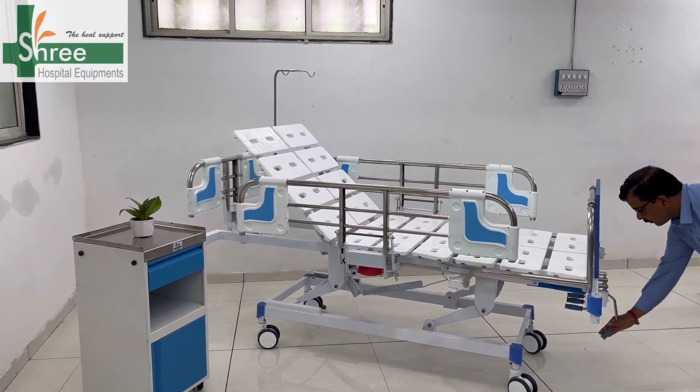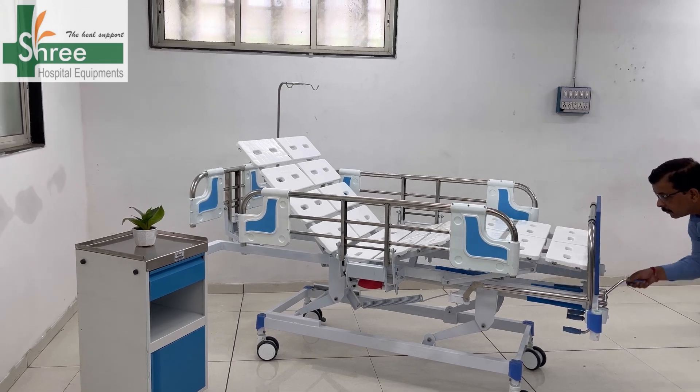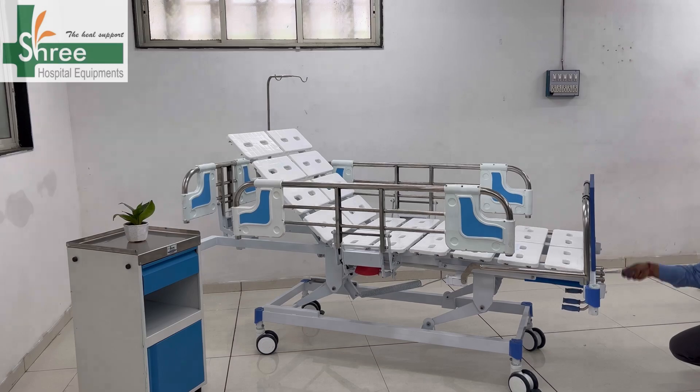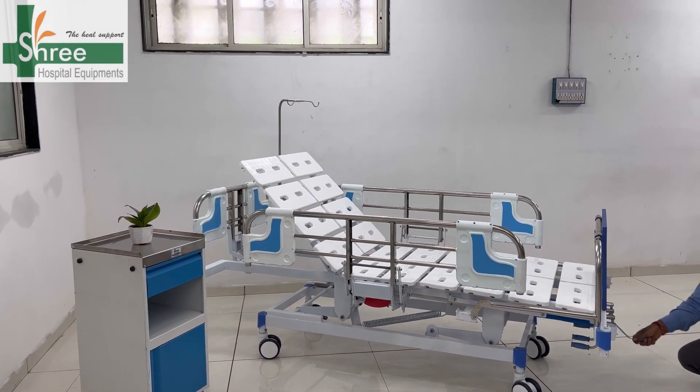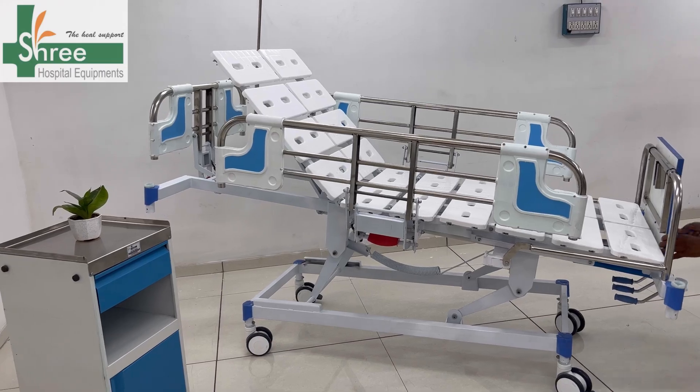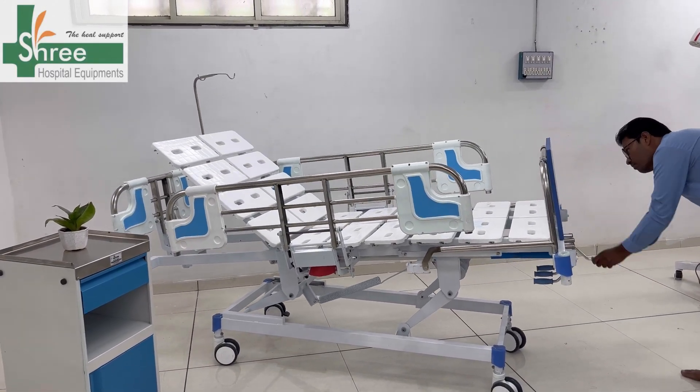Adjusting back rest. Adjusting knee rest. Height up. It can reach its lowest height of up to 45 cm. Head up. Head low position.